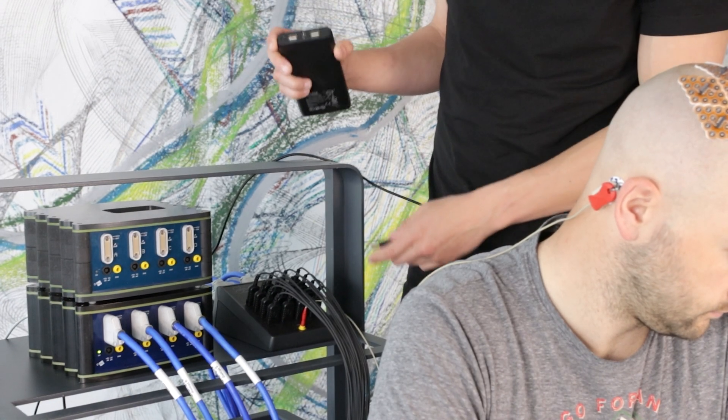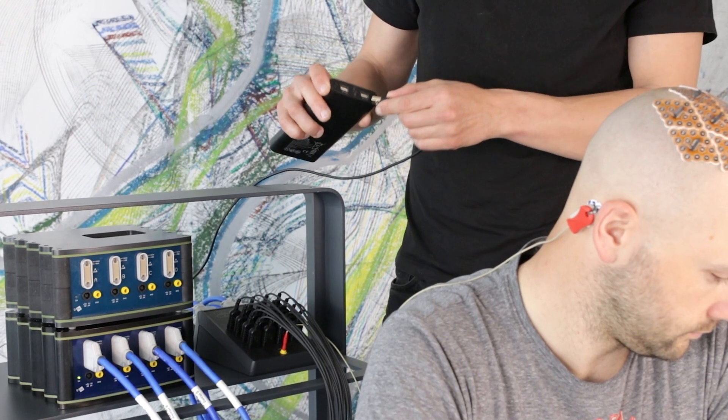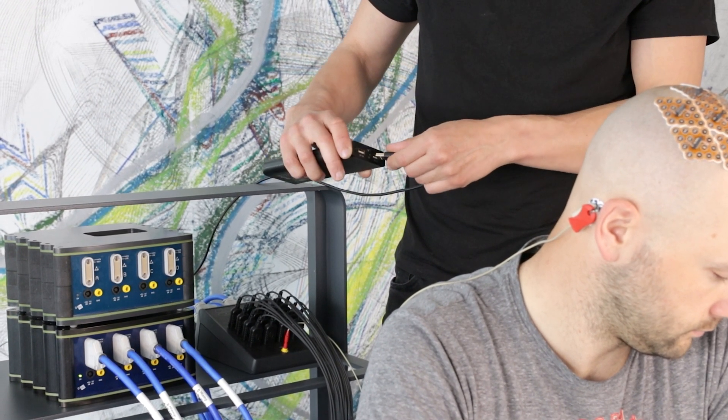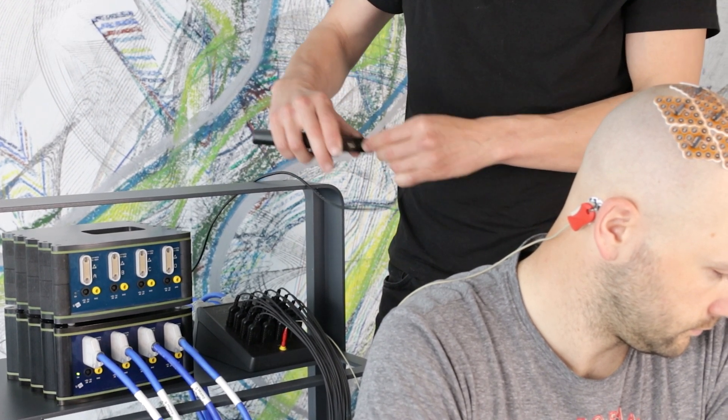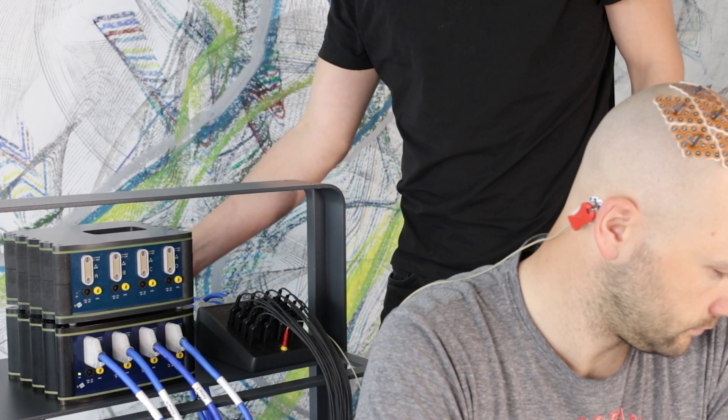Make sure that the Pangolin connector box is powered with the battery pack provided and that the LED is in green.